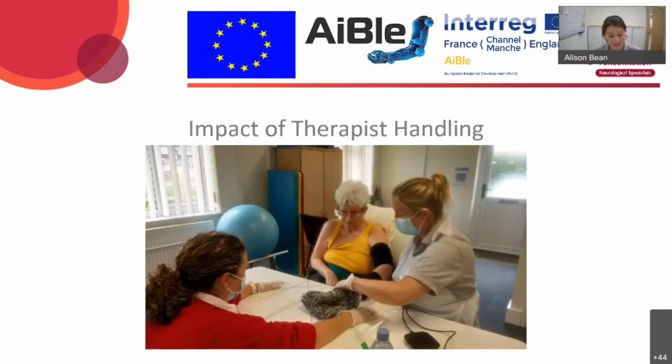So although I've just said that handling is a method of increasing a patient's activity, and it's certainly a very commonplace technique within neurological therapy, it did cause us a few problems during the EMG data collection. So you can see in this photo that the therapist's hands are very close to and at times touching the EMG sleeve, and this created quite a lot of noise in the EMG data collection.